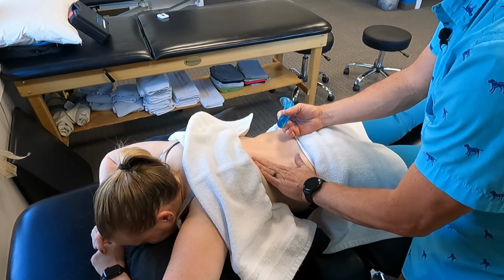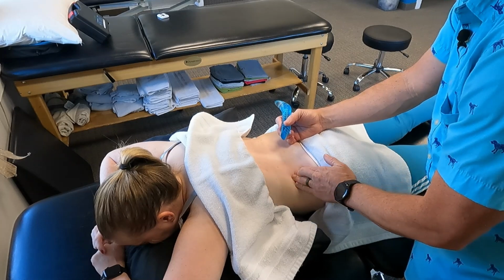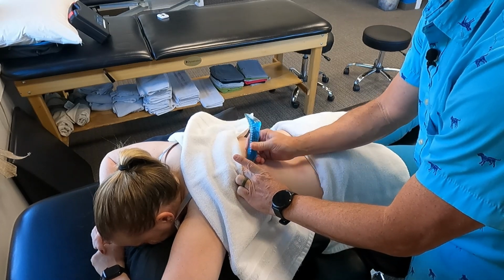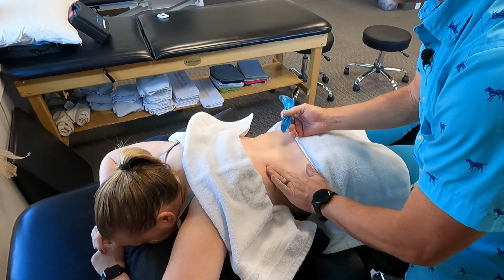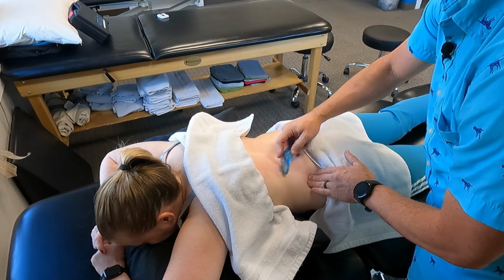And then we're going to get specific to where her concavity is. This is the area right here that tends to get really tight on Amber. So I'm going to do a little more work up through the lats, through the lower trapezius as that comes down, and I'm even going to get a little bit deeper and try and get into the quadratus lumborum.